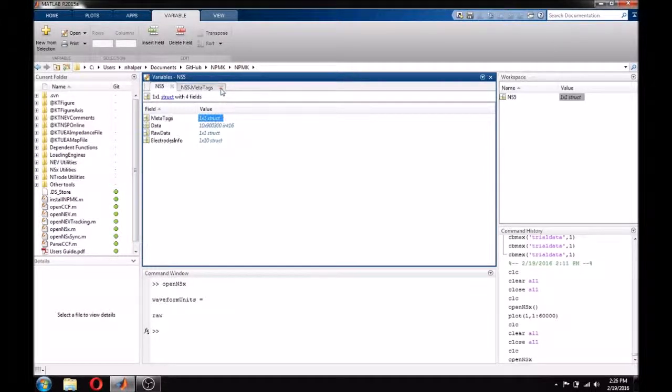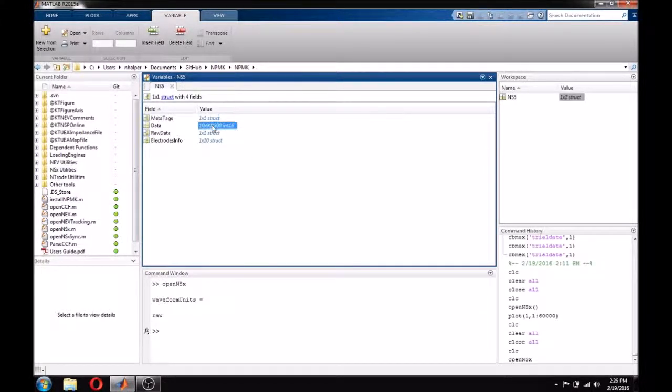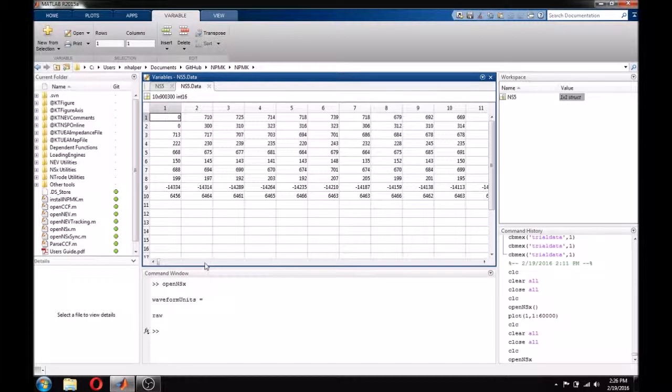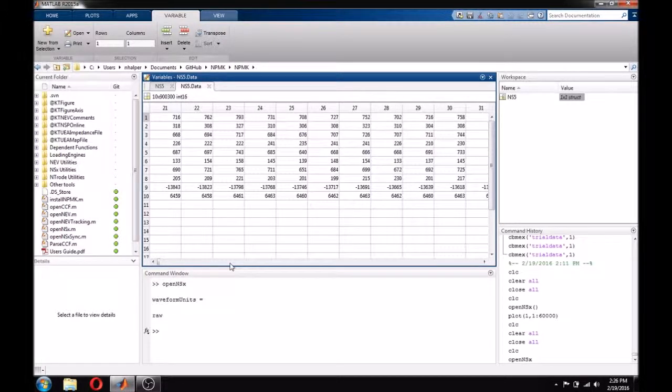Data, of course, contains the data from the file. Each row represents a channel or electrode, and each column is a data point.